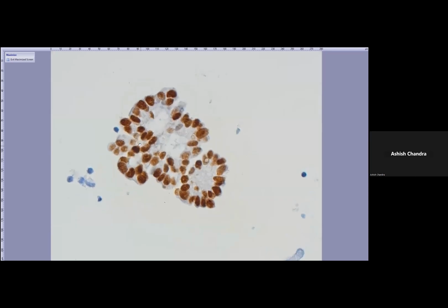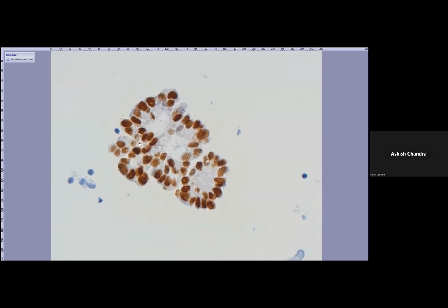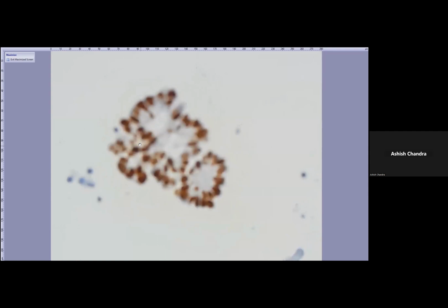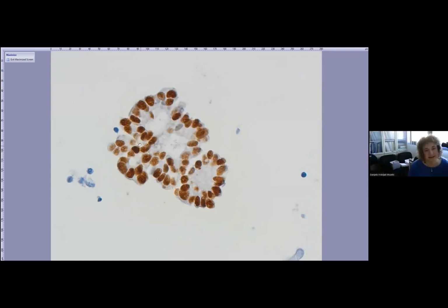So how often do you come across tubo-ovarian carcinomas in a pap smear, Danijela? Because obviously you picked up on the atypical glandular cells on a pap, and that was quite a finding. And to be able to trace it back to these, it's a great case.